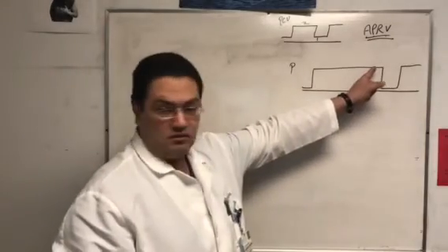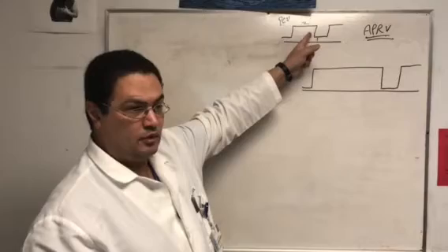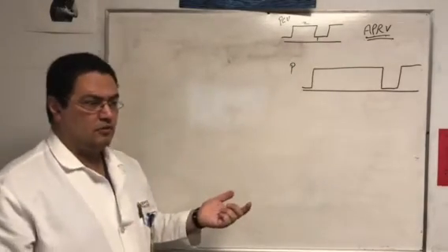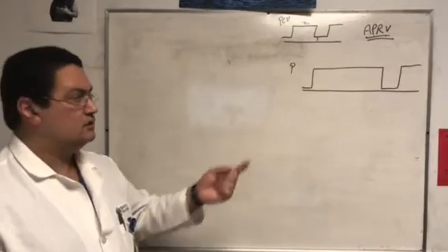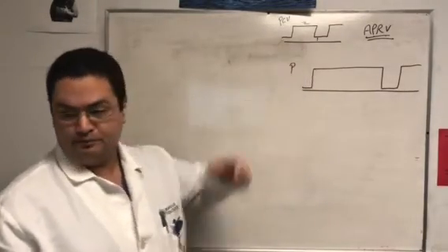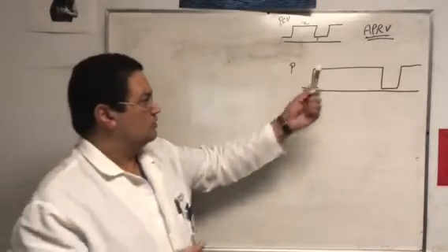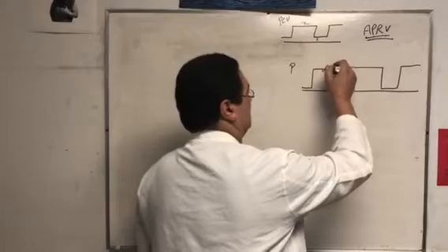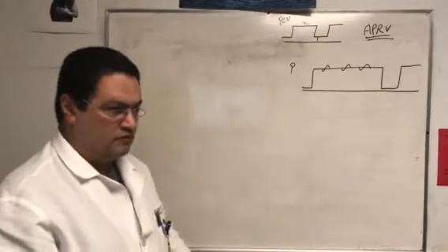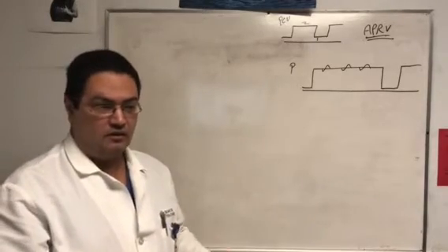Much longer inspiratory time, which we call here the high time, than pressure control, and much shorter release time. So the ratio is much more inverse. But this doesn't need paralysis, and this needs paralysis. Why? Because in this one, you can breathe on top of it. You can breathe here, you can breathe here, you can breathe here. Here, you can't.